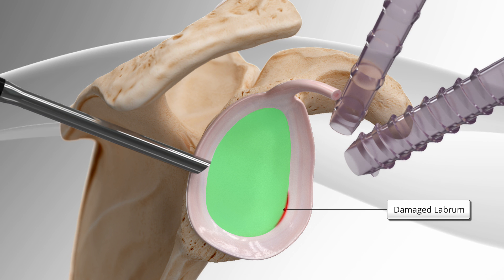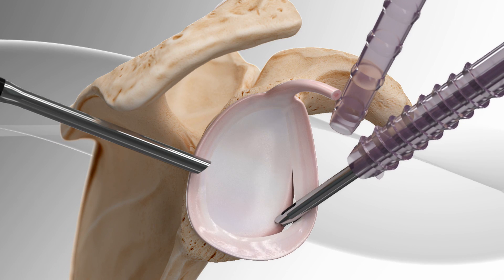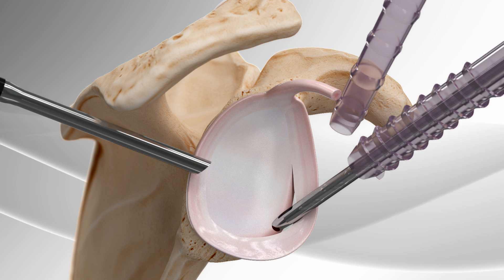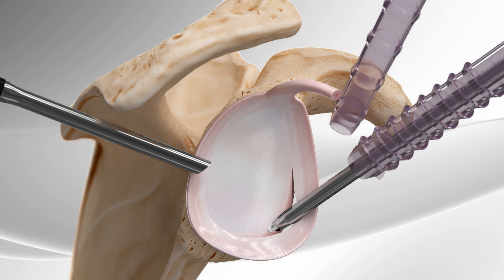First, the surgeon places a guide onto the desired location of the socket. Then, a drill is placed through the guide and a socket is created for the suture anchor. Leaving the guide in place, a knotless suture anchor is inserted through the guide and placed into the bone.